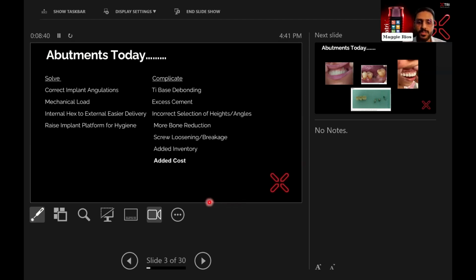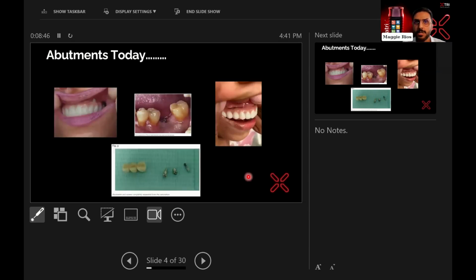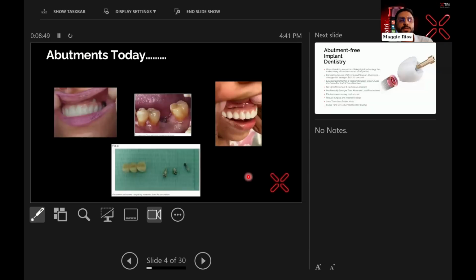Clinically, what we see here when it comes to the abutments, yeah, there you go. Clinically, you might have experienced when you're doing a full arch, the first thing the patient does is look at the full denture from up and down to see how the aesthetics are. And oftentimes they just lift the lip and see how it looks.